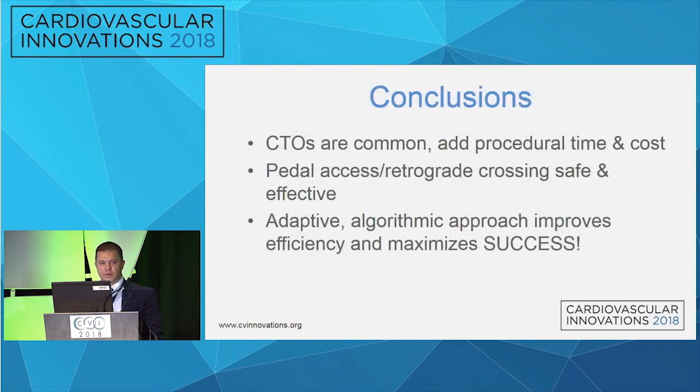So in conclusion, you're going to encounter chronic total occlusions. They do add procedural time and cost. Pedal access and retrograde crossing are safe and effective and give you a lot of flexibility in these complex procedures, and an adaptive algorithmic approach improves efficiency and maximizes success.